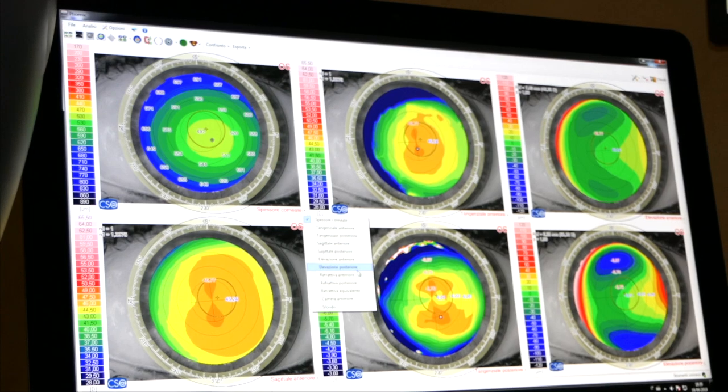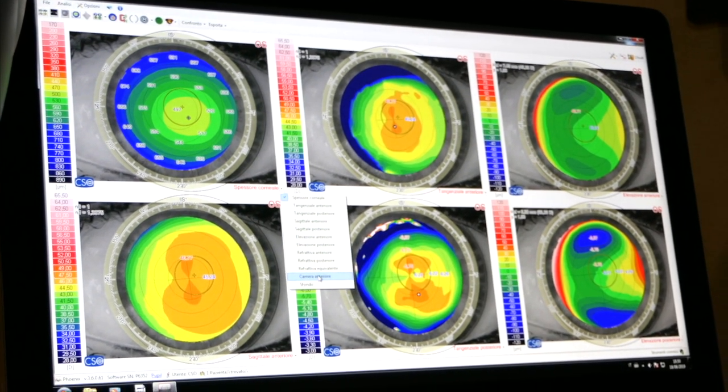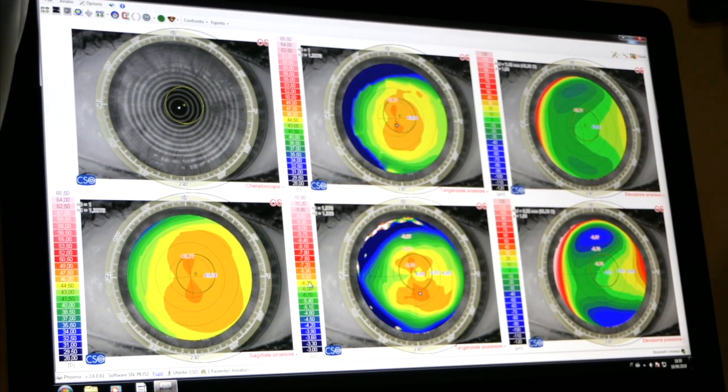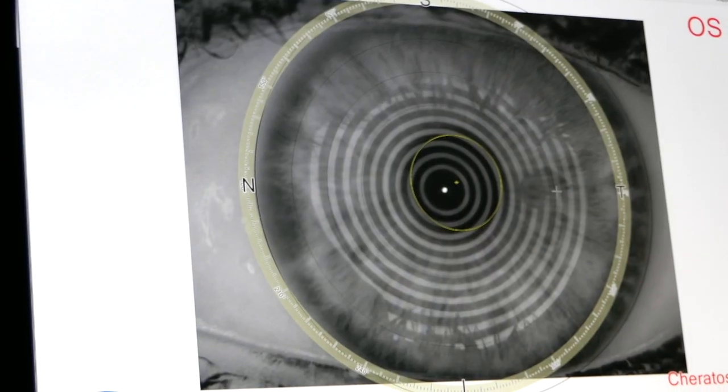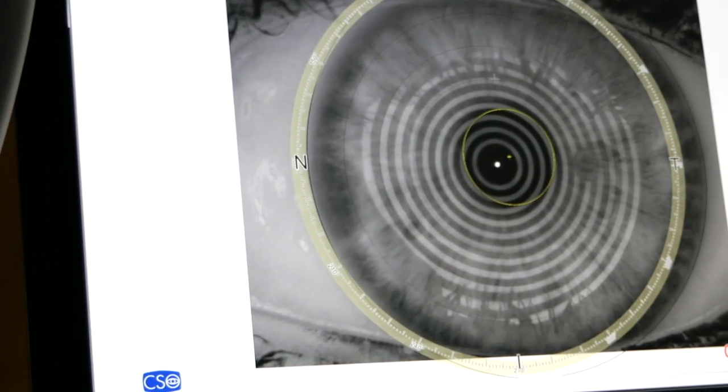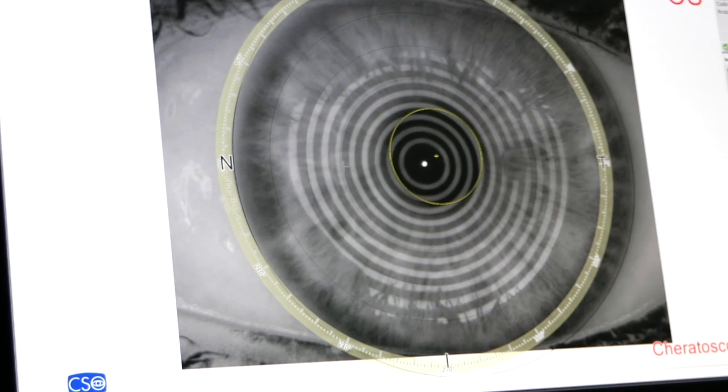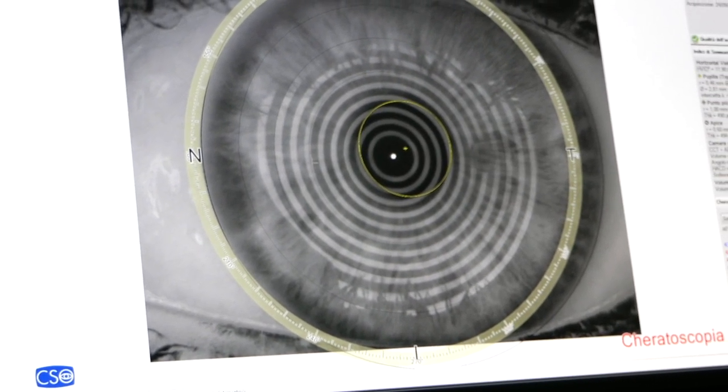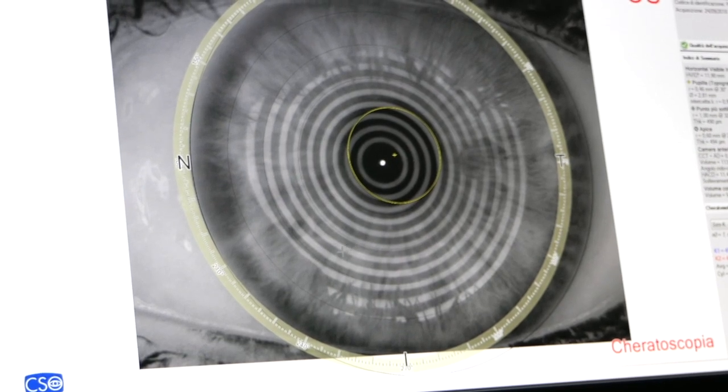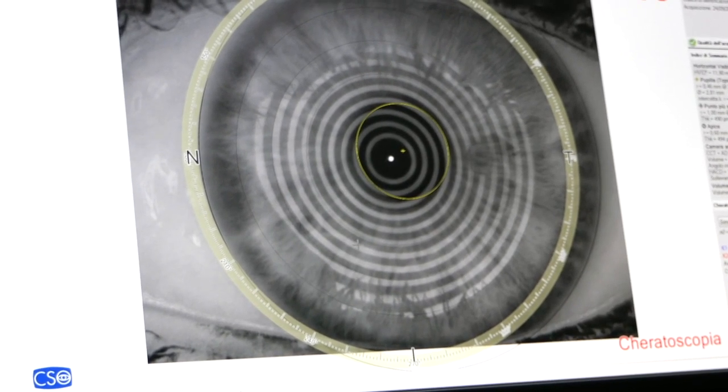Depending on how they are reflected, the computer is able to interpret and define what is the range of curvature of the cornea. The smaller the reflected circles are, the more the cornea is curved.